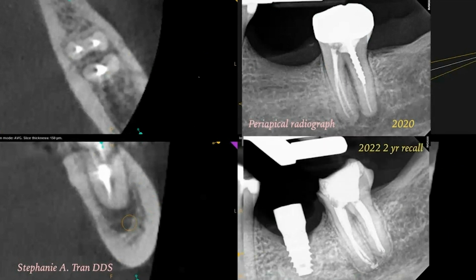Because upon retreatment there were no signs of a cracked tooth or vertical root fractures, retreatment was recommended, it was completed, and upon the 2-year recall, this patient had gotten their implant, but we can also note that they had full bone healing around this tooth after my endodontic retreatment. So we can see that the 3D scan was helpful for making the diagnosis and making our decision to retreat this tooth, and it gave this patient the chance to maintain her tooth.